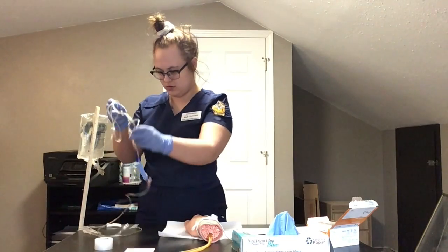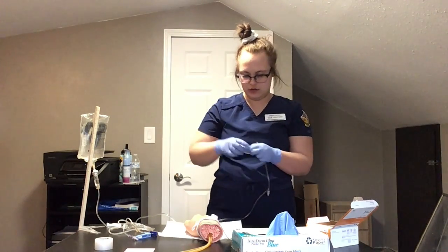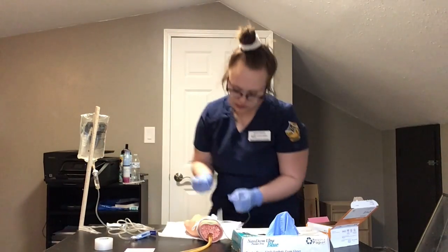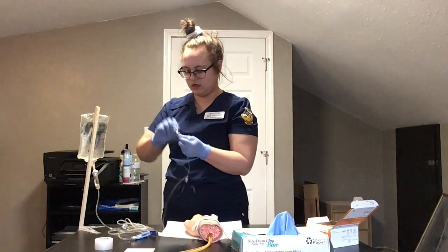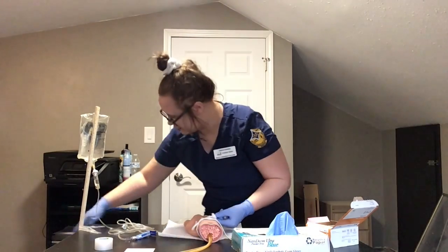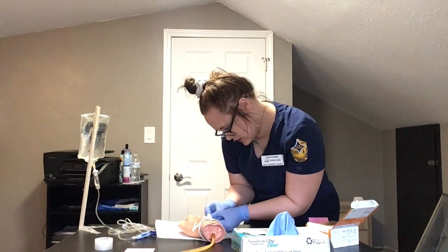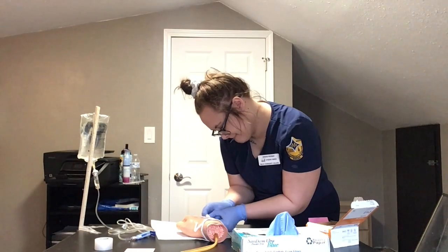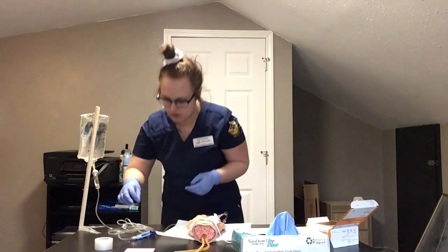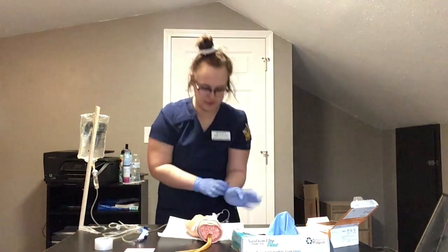Get this bad boy. I'm gonna get another alcohol prep pad. Cleanse this again. Get another one. Cleanse this one. And I'm gonna connect them. Okay. Then I'm going to unlock this and it'll start infusing.